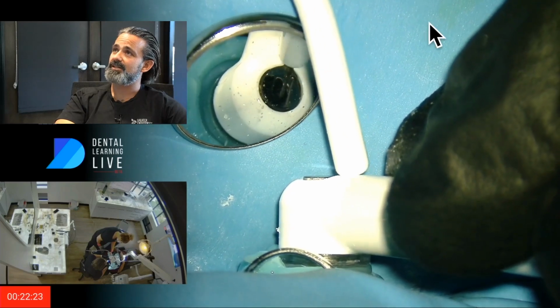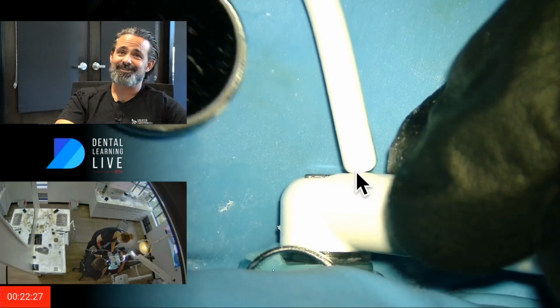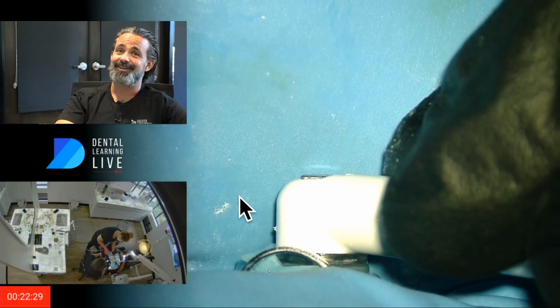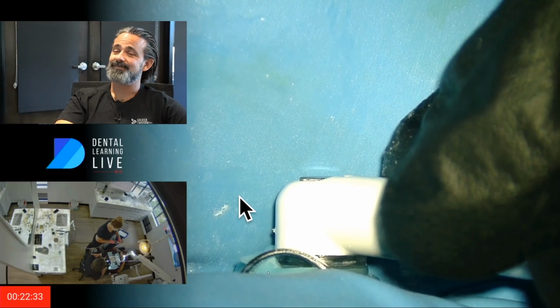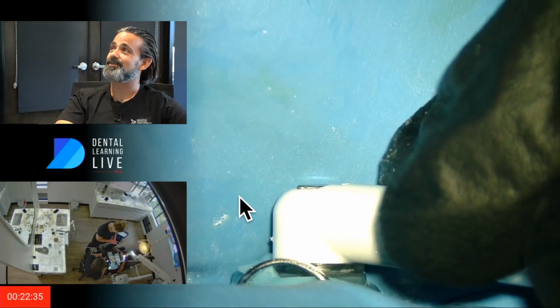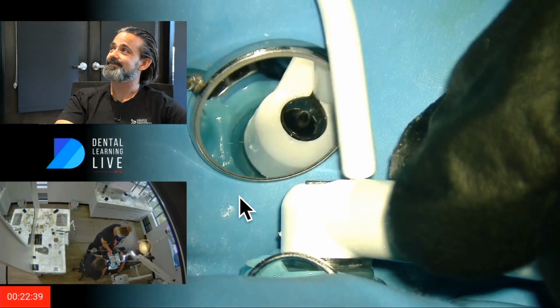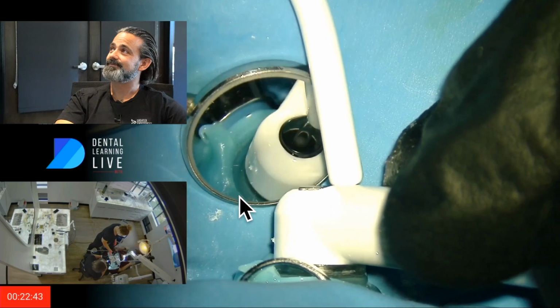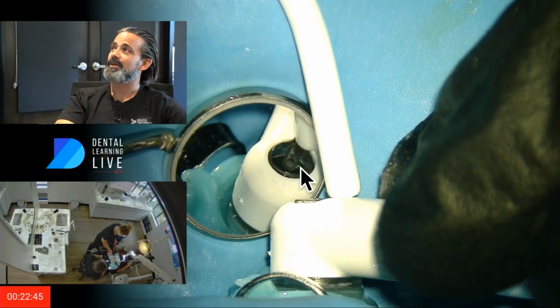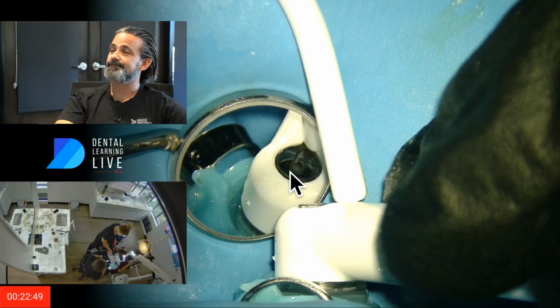Lindsay's catching the exhaust because I told her to, because I was getting annoyed with the specs on my mirror. She's done with her notes, so I can do something with her. How pretty. So again, very consistent. The bubble is just right there.